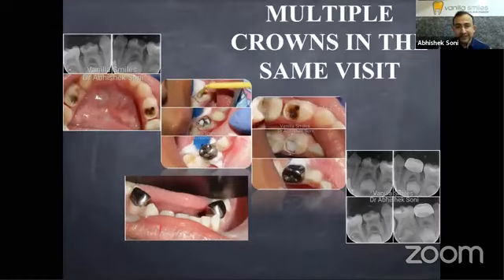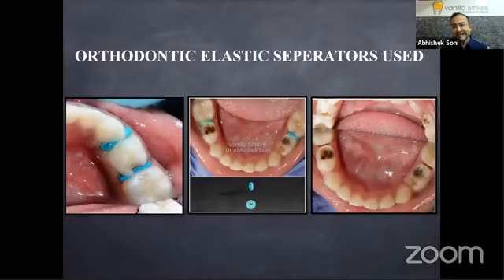So if you see over here, open carious lesions, however, a clear band of dentine, which was seen in 7.4 and 8.4. We did something called SMART Hall's, that is SDF modified atraumatic treatment. We selected both the crowns in the same visit, and we luted the crowns in place. This is the elastic separation, and that's the amount of separation that you will achieve eventually after 24 to 48 hours.